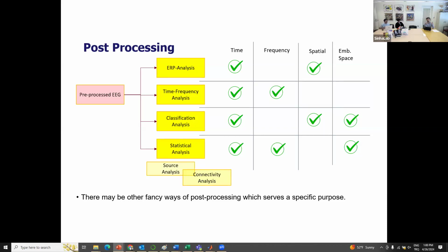And for example, statistical analysis is a large universe of techniques that I'm probably not going to be able to capture by just saying that there are subclasses like source analysis, connectivity analysis. Like, for example, causal analysis is yet another one, and it's a very difficult one because understanding the difference between correlation and causality is particularly challenging, and it's still ongoing. There is lots of ongoing work on that branch.